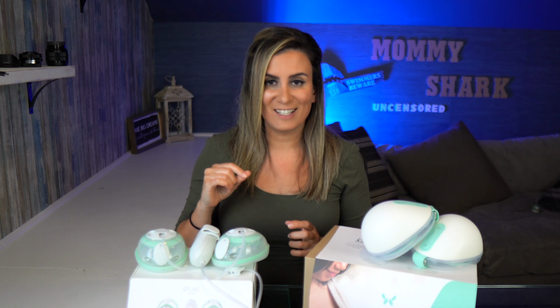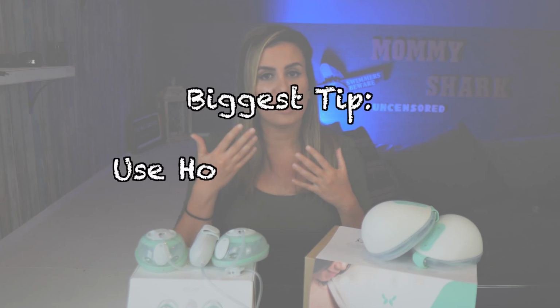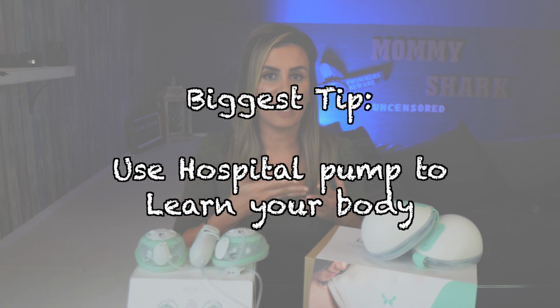One thing I want to disclaim, as I always do in my videos, the stronger the suction does not necessarily mean the more milk you will get. Everyone's different. Check out my Willow and Elvie Facebook group where women discuss their different experiences with these pumps. So what you need to really do, if you already have a pump or if you're at the hospital and can get your hands on a pump there, is learn what suction you better react to. And that is my biggest number 1 tip.